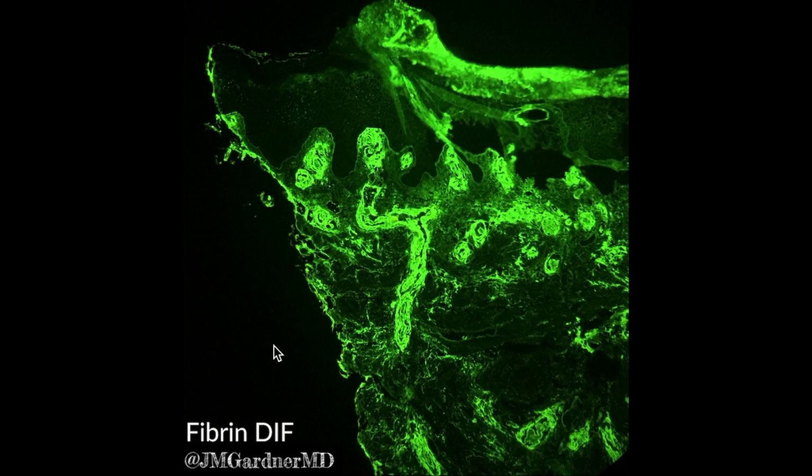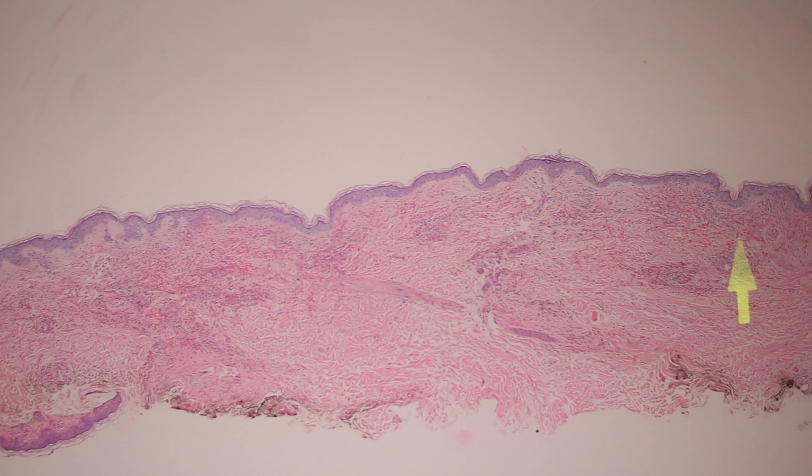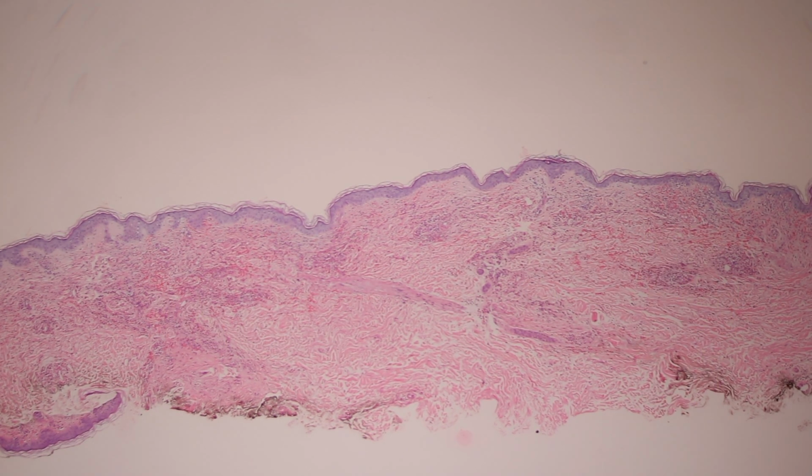So this is a good example of what we see. I don't have a C3 picture handy, but it's going to usually be a lot more subtle, but you're going to see little granular C3 deposits in the vessel walls around these same vessels in a typical LCV. In Henoch-Schonlein, you'd see IgA granular deposits, very subtle around these vessels as well. Okay, so when we see vasculitis that is just superficial like this, that's the typical finding. But when we see it going deeper into the deep dermal vessels, if there's significant deep dermal involvement, we have to start thinking about the possibility of systemic vasculitis. And sometimes I'll actually specifically raise that possibility in my reports to make sure that the clinicians know to do additional workup.